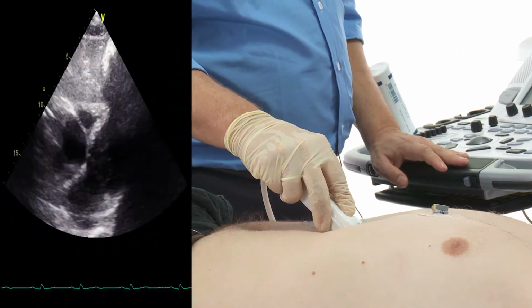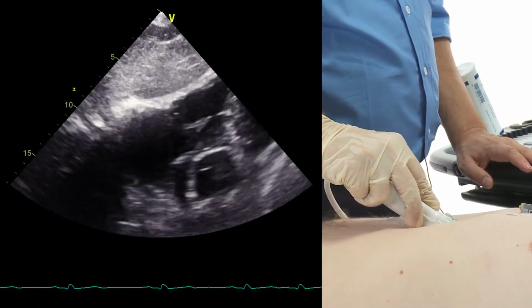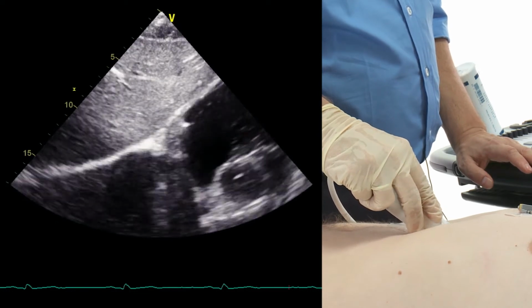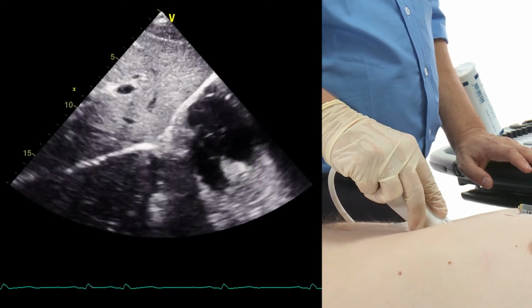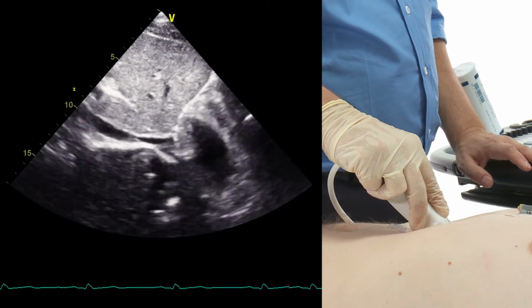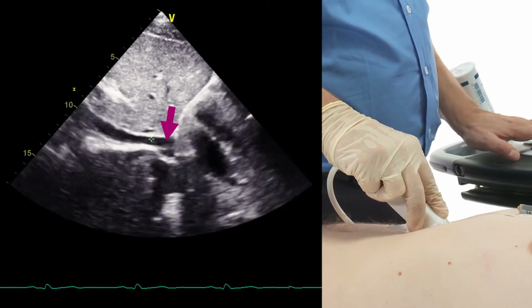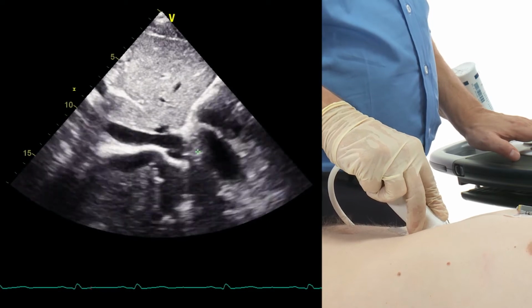Now, how do you get to the inferior vena cava? It's two different motions. One is a motion towards the right shoulder, and at the same time, we're rotating the probe counterclockwise until all of a sudden we see the inferior vena cava here, how it enters the right atrium.